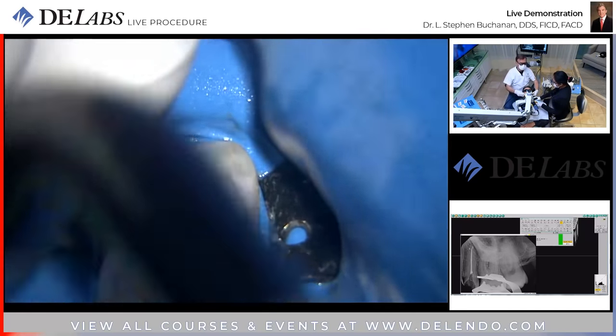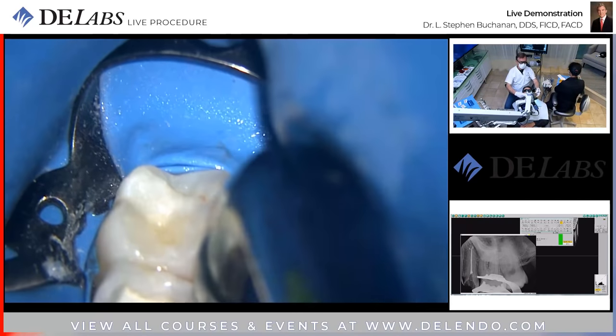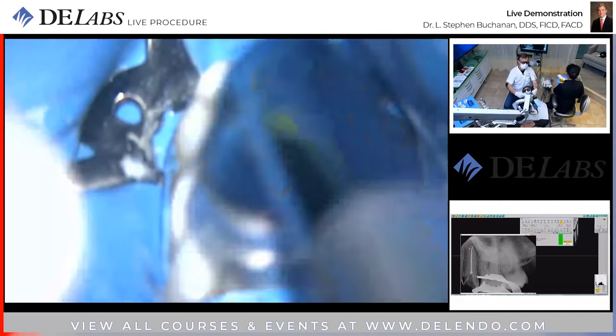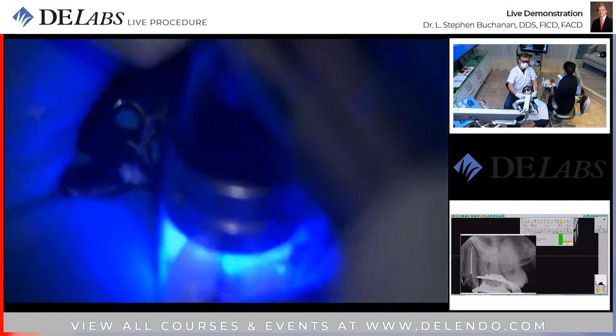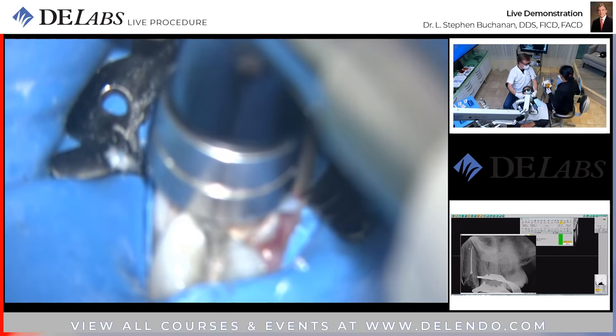And here comes the plasma arc. The only time I need to be really careful about the speed of curing is if I'm doing deep buildups. So all you've got to do is do a layered technique.